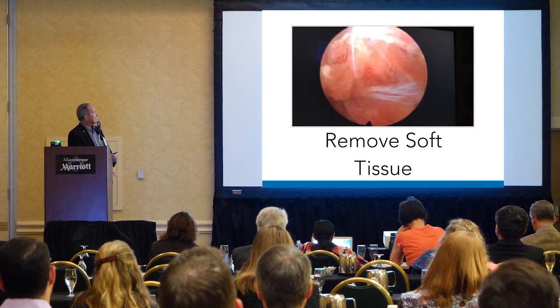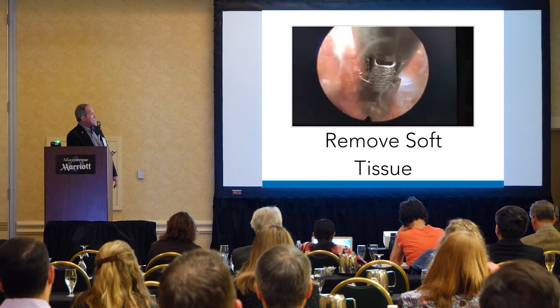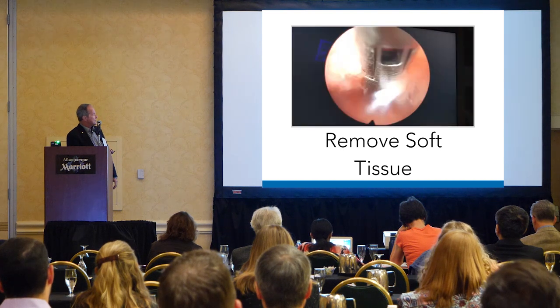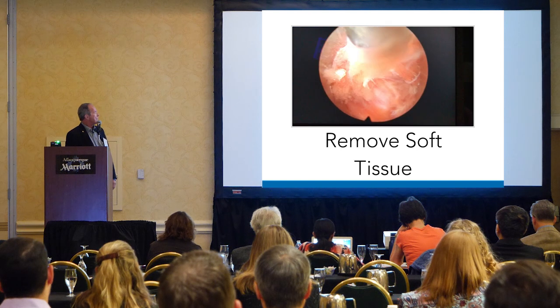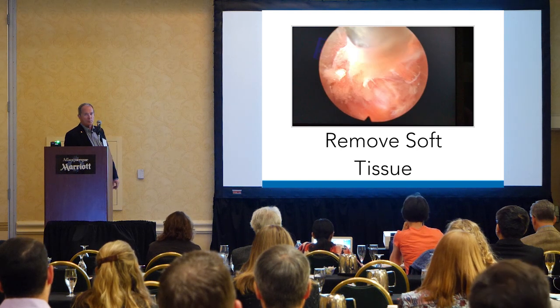So here we are. This is just the first part, where you take some of the muscle off of the descending facet, just removing it, grasping it. The next part is using the thermal probe a little bit.